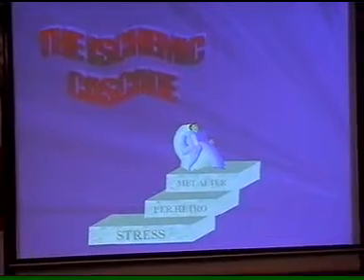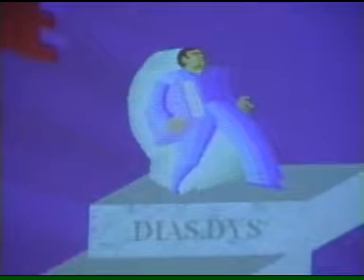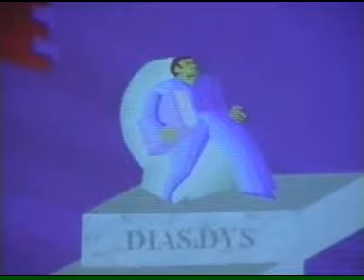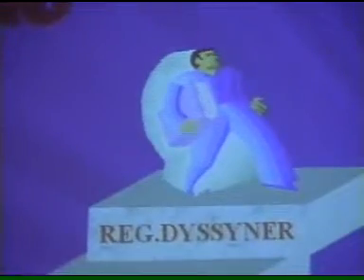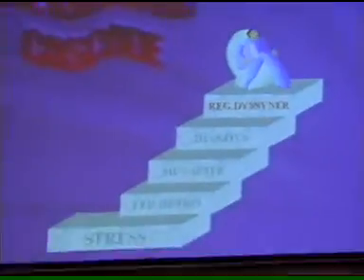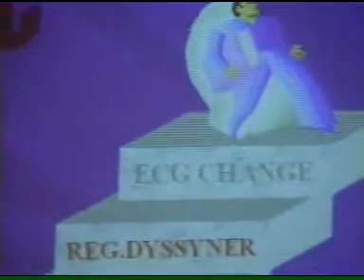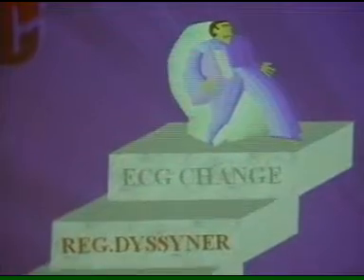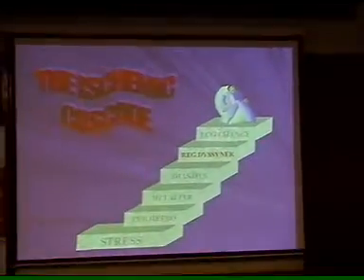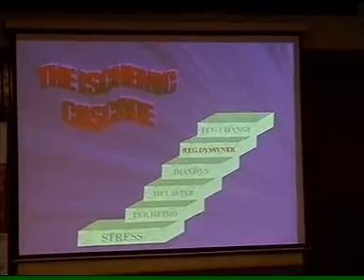So the changes take place, and the diastolic component of the ventricle is disturbed, and still there is stress going on, and then comes the regional dysynchrony, that is, the regional wall motion abnormality, and then come the ECG changes. In fact, now you understand the ECG changes come quite late, where the ischemia has started right from the first step. And that is why the sensitivity of ECG is quite low as compared to other modalities.